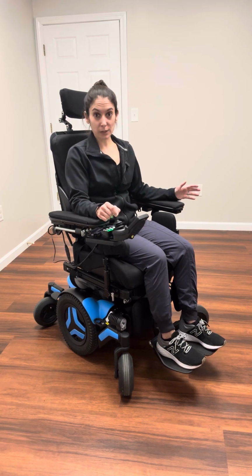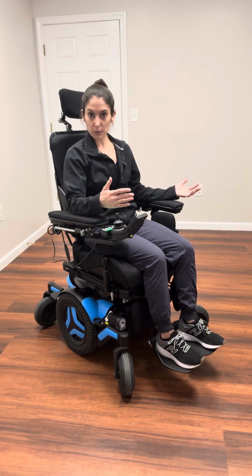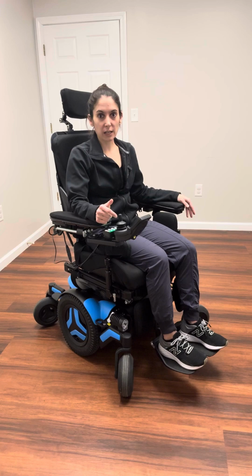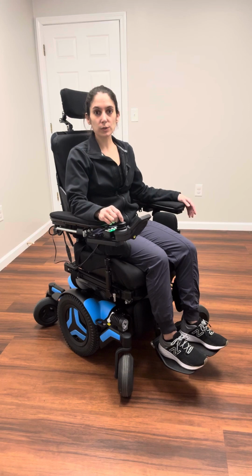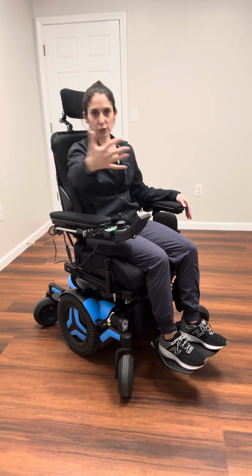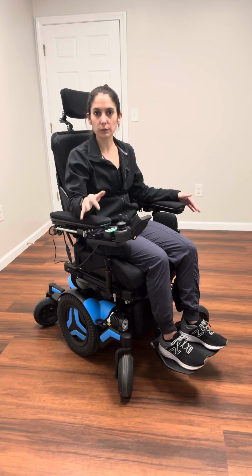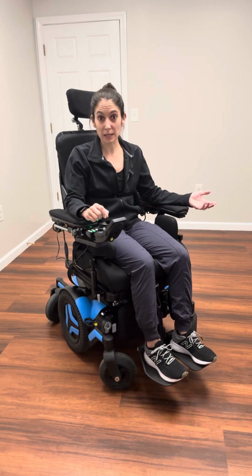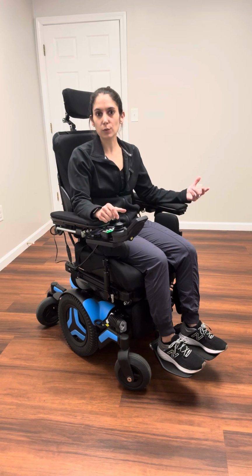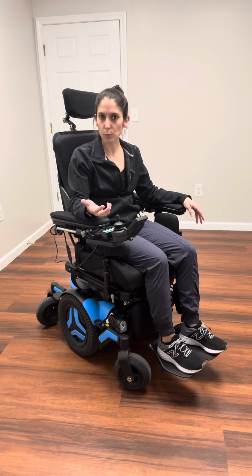And then for a rear-wheel drive chair, that pivot point is in the back of the chair. So as you're turning, more of the chair is in front of you. That chair definitely has a bigger turning radius than a mid-wheel drive chair. It also takes the widest turns in comparison to all 3 chairs whenever you're taking a 90 degree turn from left to right. Another pro of a front-wheel drive chair is that it does better if you are navigating a lot of uneven ground. Rear-wheel drive, when it comes to uneven ground, usually does not do as well.